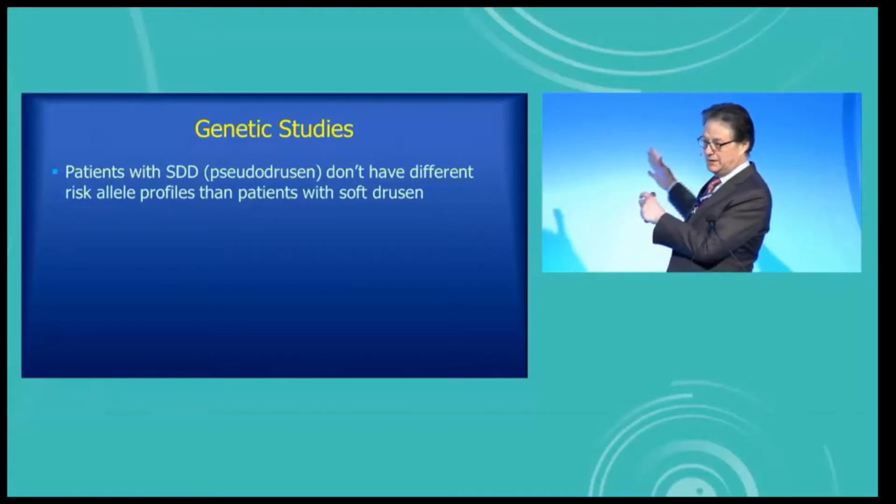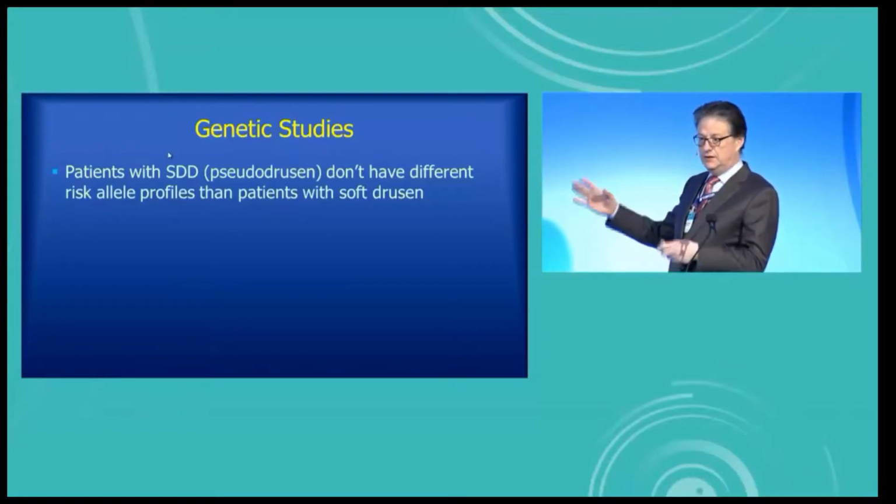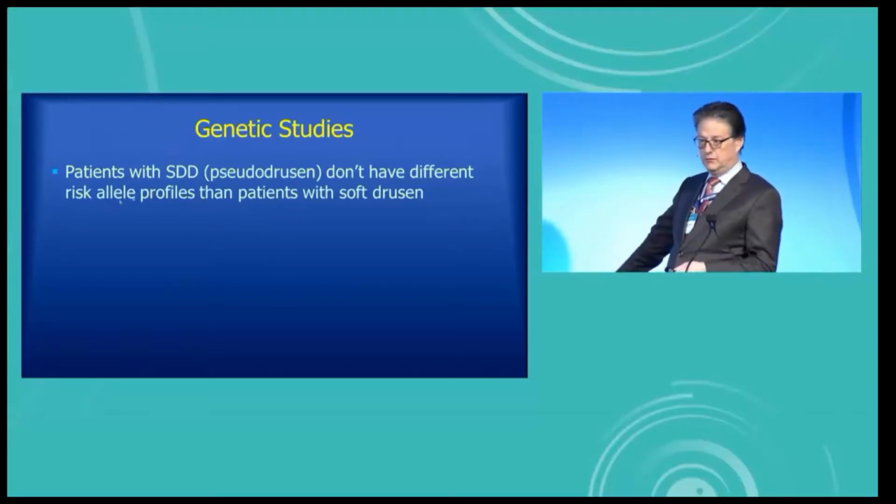So to be able to classify or understand the early manifestations of AMD, you need to have an OCT that lets you look at how thick the choroid is.